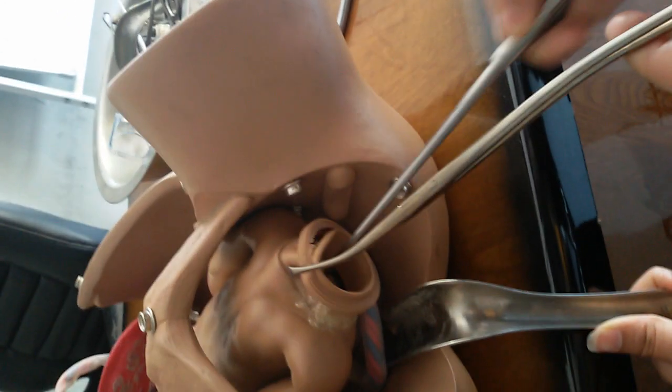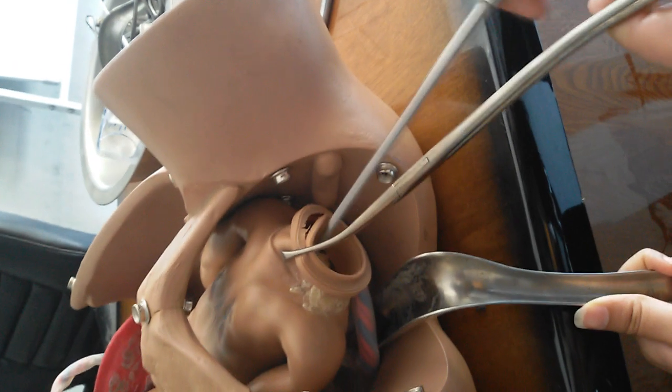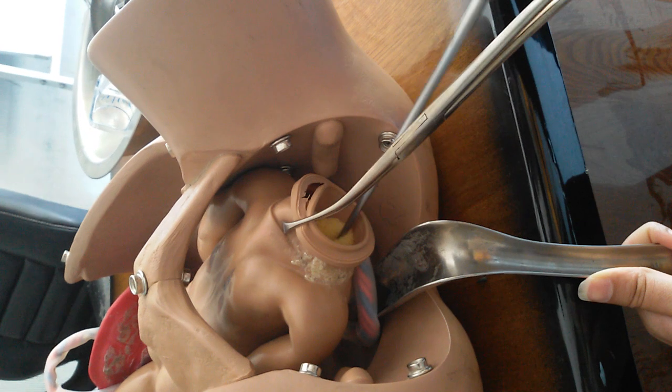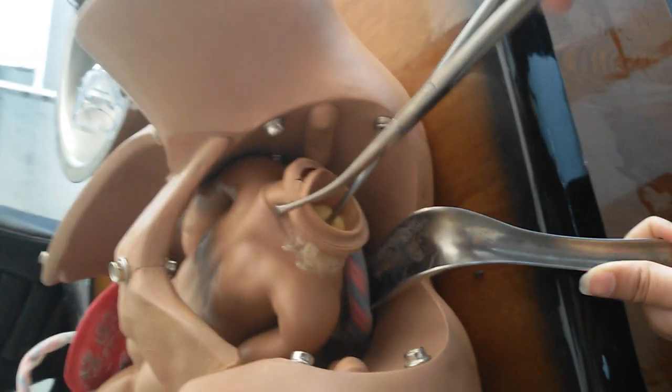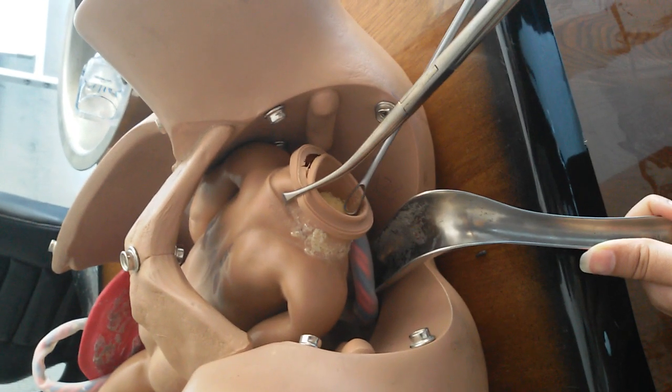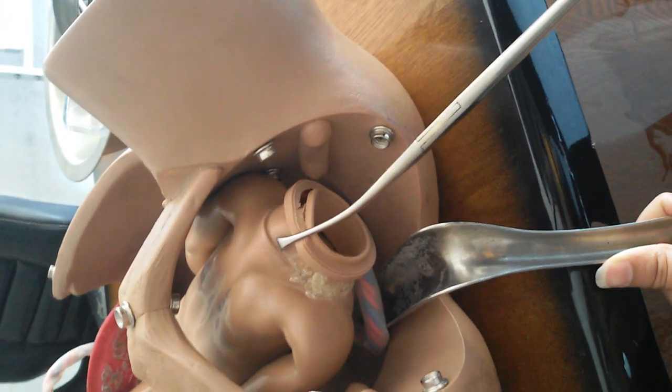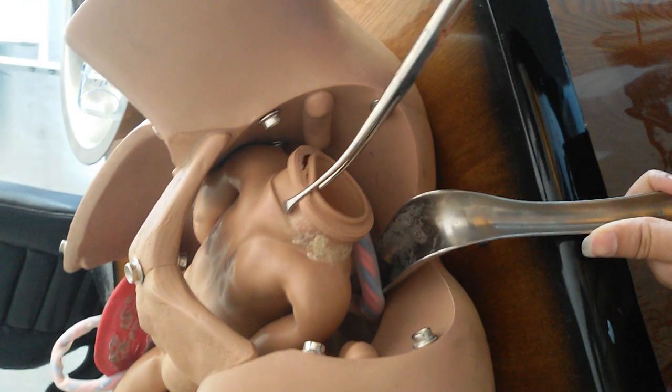We do not insert the curette more than eight centimeters. We clean the anterior wall, lateral walls, and posterior wall until we feel a gritty, rough surface — like moving the instrument over a cracked surface — rather than smoothness. After this, the uterus should become contracted.